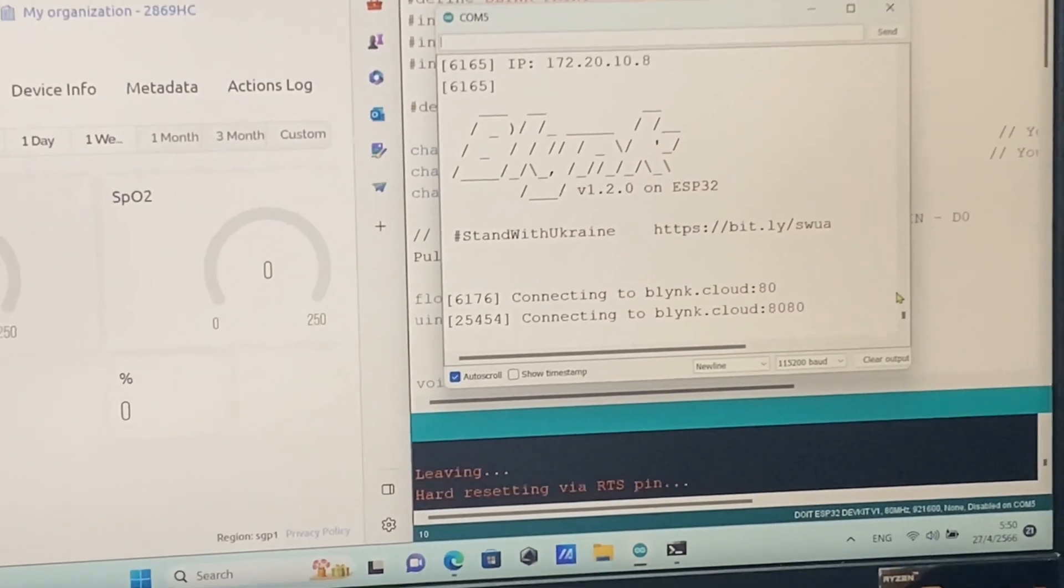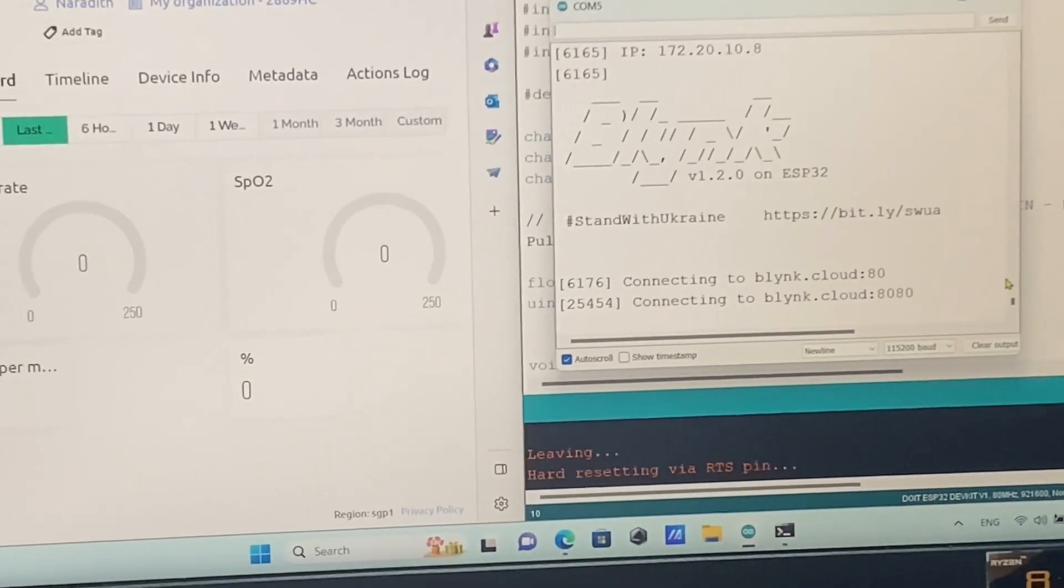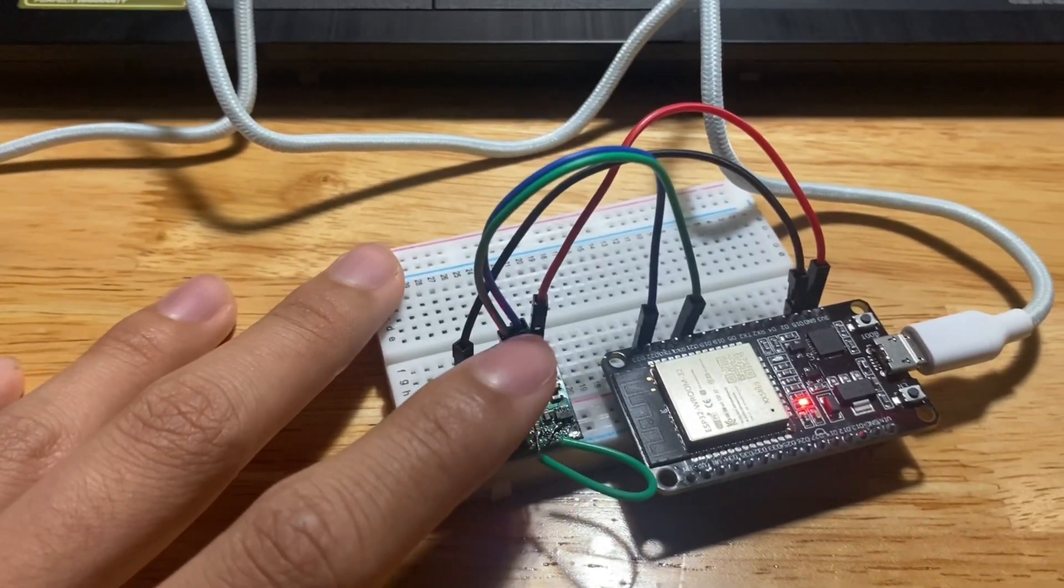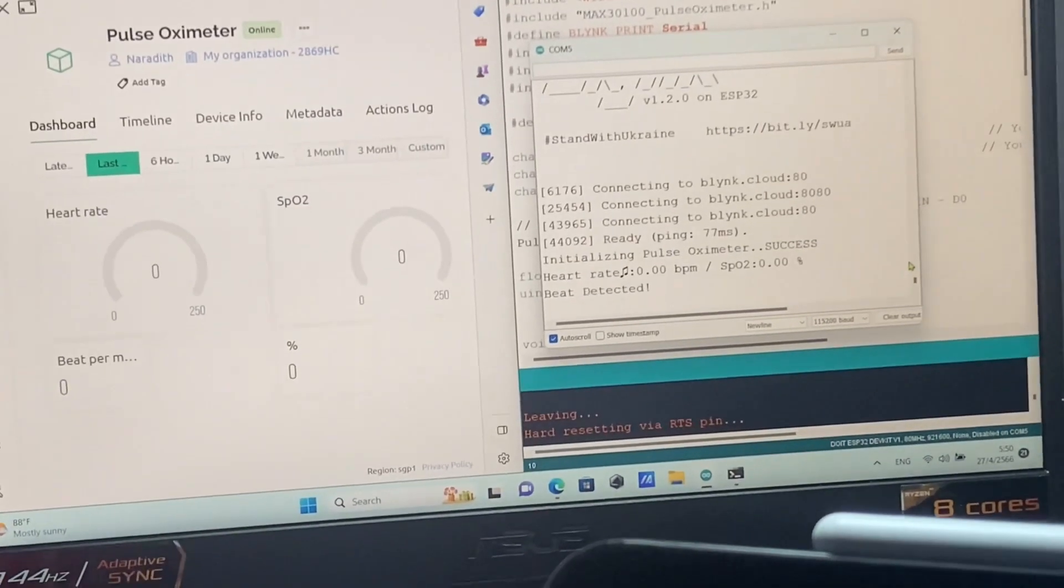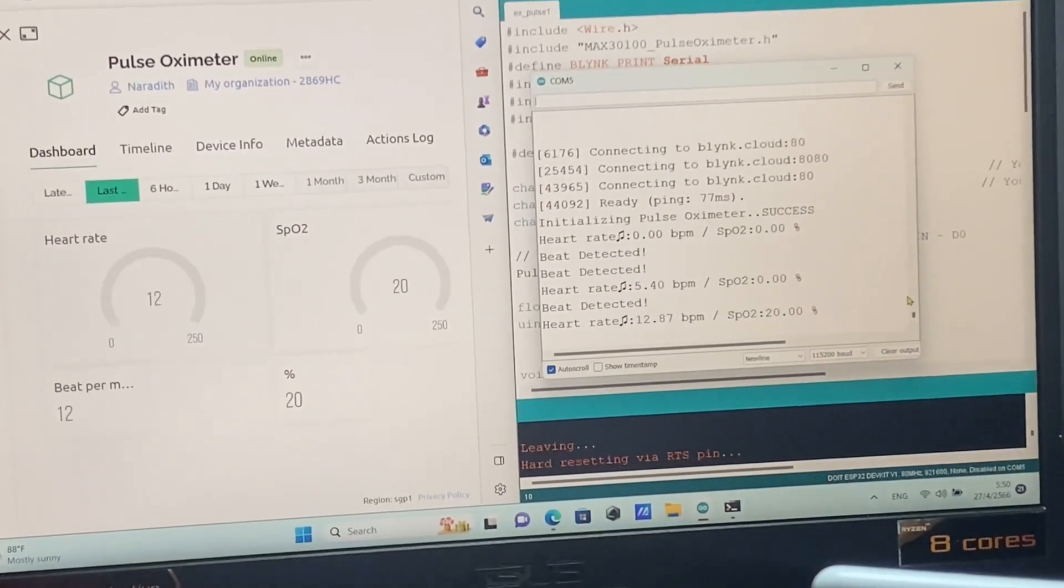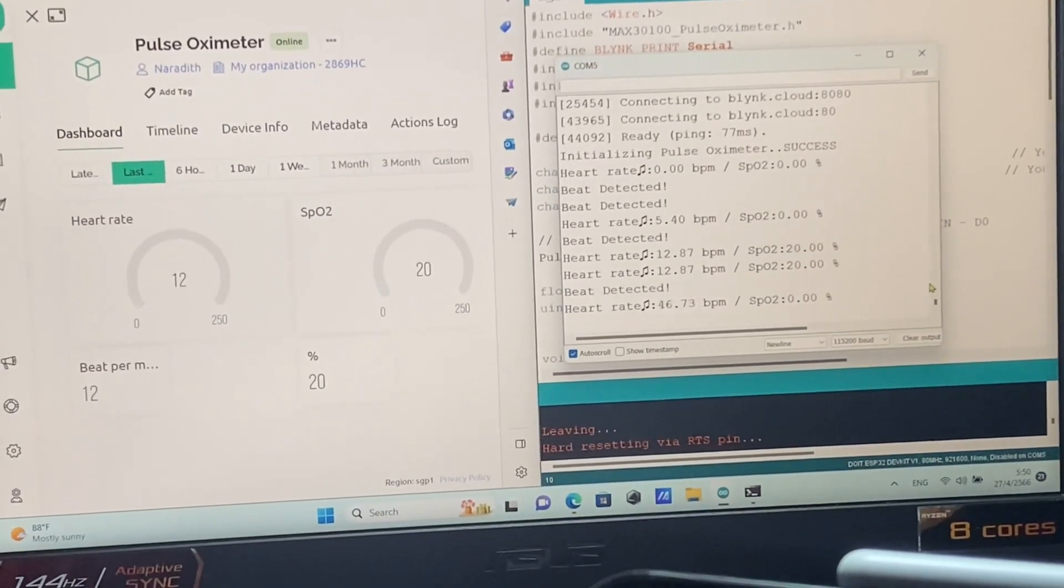After we finish the circuit and upload the code to the Arduino, the results on the serial monitor will show you that the heart rate can be detected.